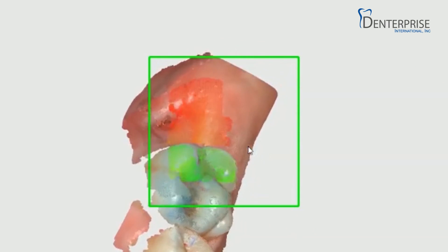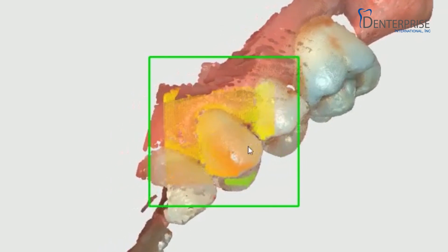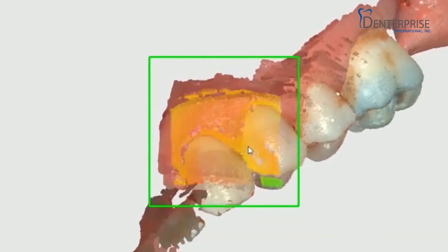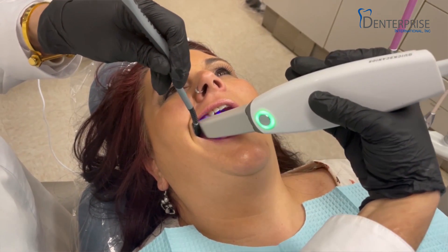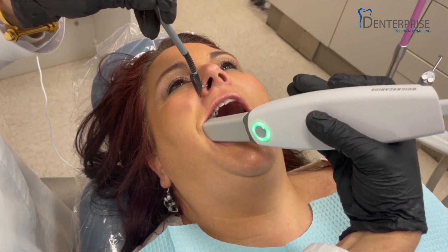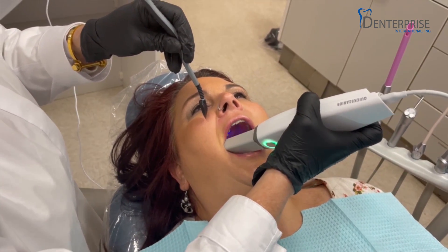The QuickScan iOS is an open scanner that is full-color while still being powder-free. Extremely fast, incredibly accurate, the QuickScan iOS provides superior results as you communicate with your lab. Its lightweight and compact ergonomic design will allow you to provide your patients a much better experience over old-fashioned impressions.